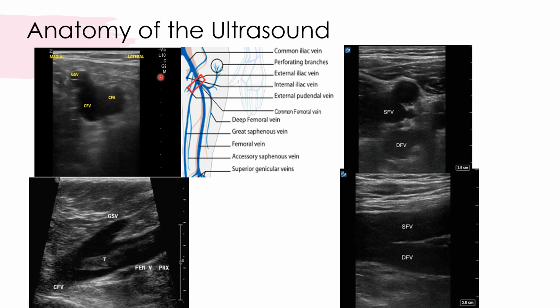But if you wanted to progress and find whether there was any additional clot, or how far down this clot went, then you're going to follow down and you can identify the superficial and deep, or profunda, or deep femoral area, where you can see the separation of those two vessels, and you can compress them, making sure that they both are compressible. That same area right here we see our superficial and our deep.